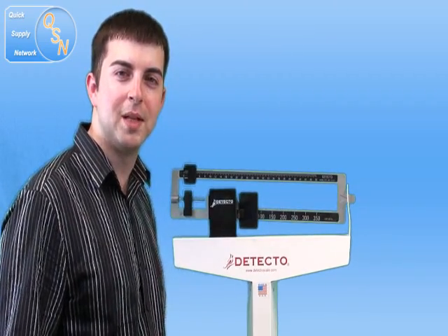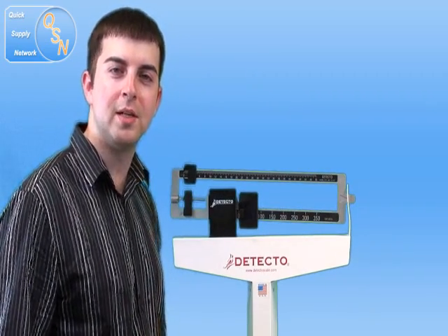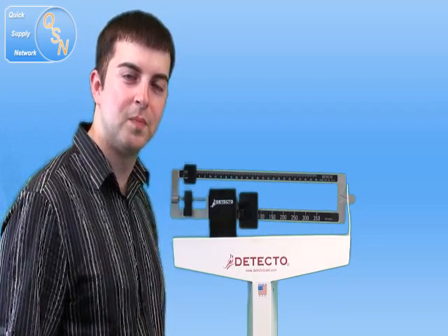Hi, Jordan here with Quick Supply. Today we're going to show you how to assemble the Detecto 439 Doctor Scale.